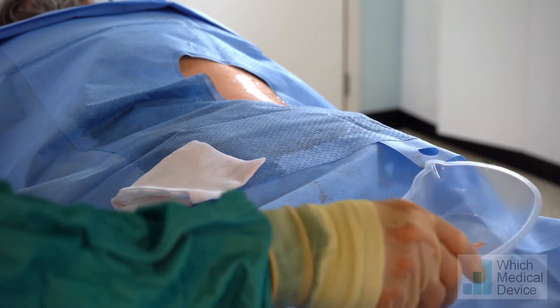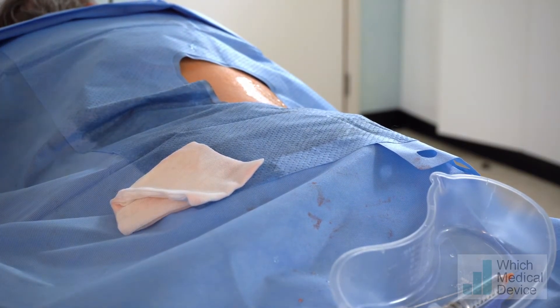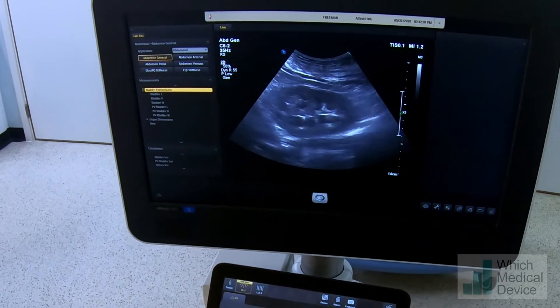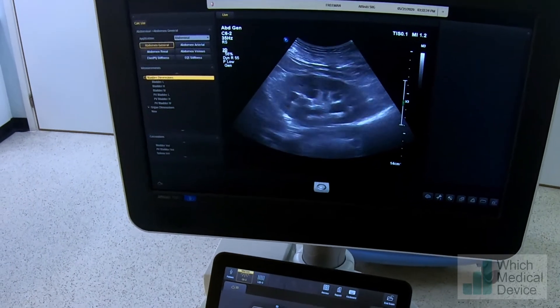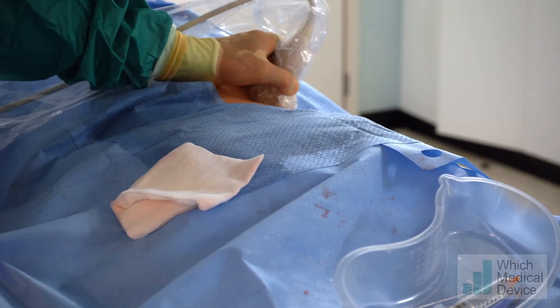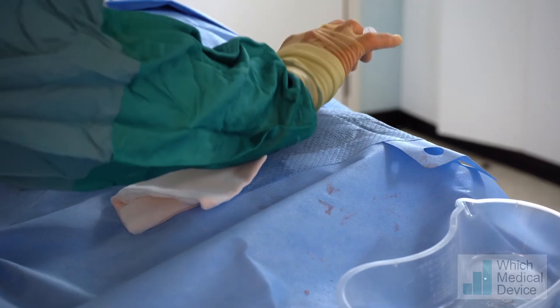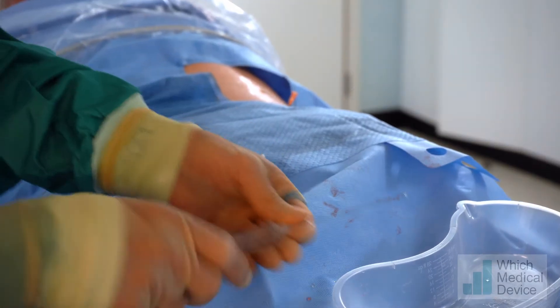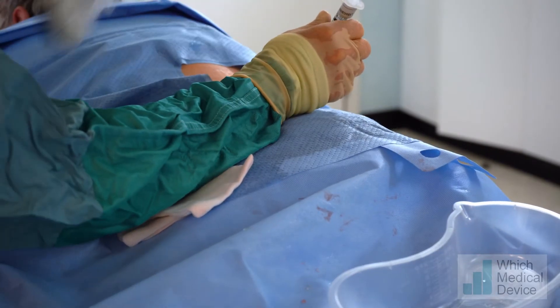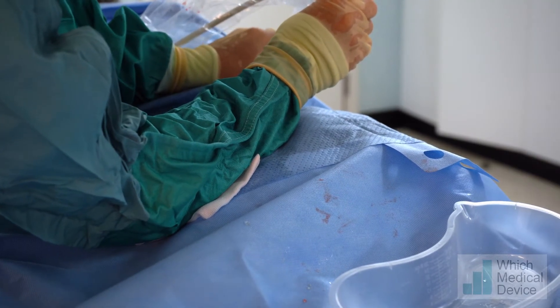We're now going to look at the other side. On this occasion I'm going to reach across and work from this side. Looking with the ultrasound, we've got a reasonably dilated collecting system — this side is more dilated than the left. We're again going for that second lowest calyx. A sharp scratch coming up with the anaesthetic. We're using the spinal needle again to go down to the renal surface, anaesthetising the tract all the way down to the kidney — we can see on ultrasound exactly where we're going with the anaesthetic.